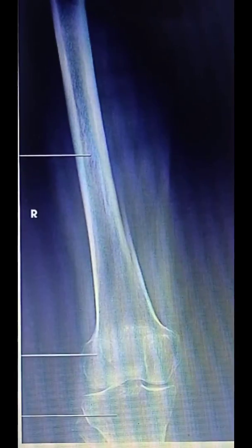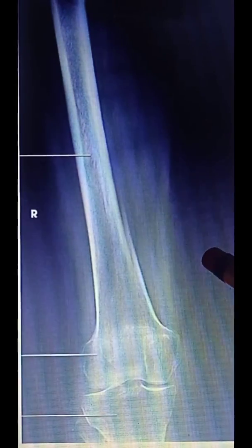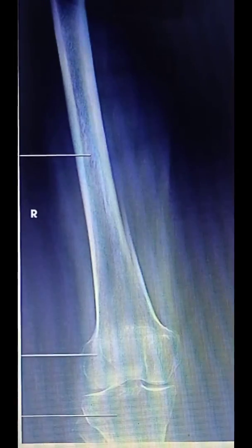So, no rotation is evident because the femoral and tibial condyles should appear symmetric in size and shape. The femoral condyles appear symmetric, and the approximate medial half of the fibular head should be superimposed by the tibia. So here it was superimposed by the tibia. Then the femur should be centered to the collimation field and aligned with the long axis of the IR, with the knee joint space a minimum of 1 inch.